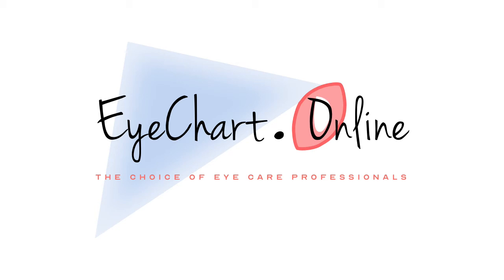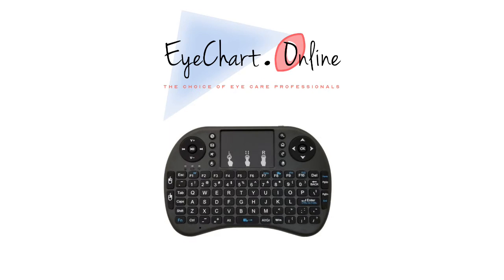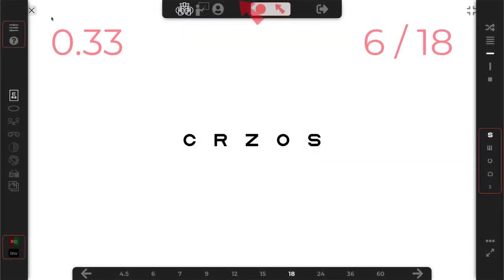Okay, so working with a small wireless keyboard, this is my favorite way to control the chart and is usually how I use it in practice. Almost all of the functions, features, charts, and targets have an associated keyboard shortcut. So if you get a little mini wireless keyboard like this and you keep it with you like a remote control, you can quickly switch between charts by using the shortcut keys.